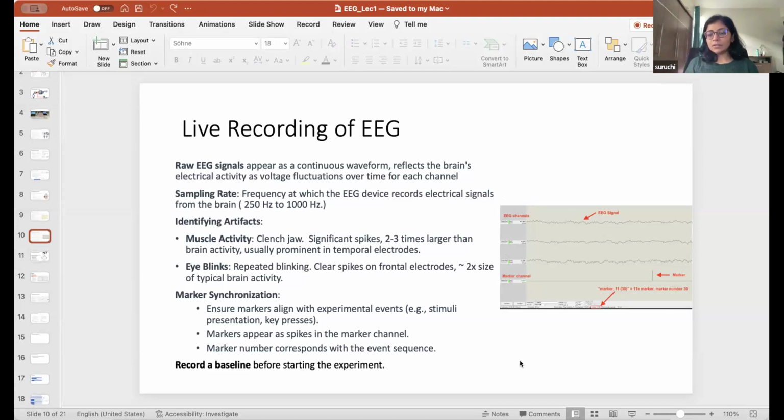The bottom x-axis units are time, so they'll be seconds. And what you're getting, we call it EEG signal, or continuous EEG waveform. And that is for each channel that we have, other than reference and ground, you will see a line like this, which will have the wiggles. So these are all EEG signals for all the electrodes in your system minus the ground and the reference. Okay.